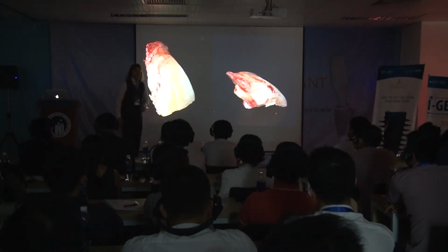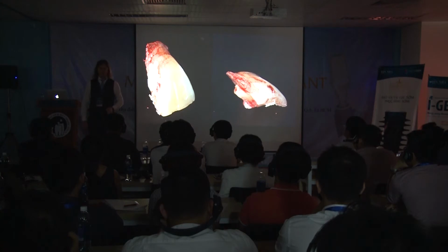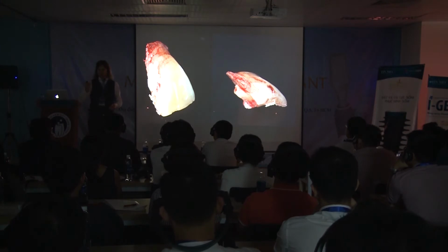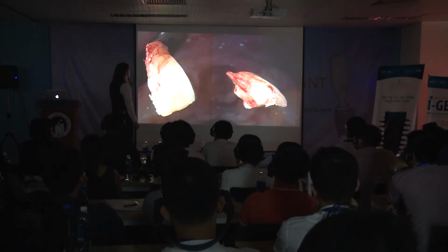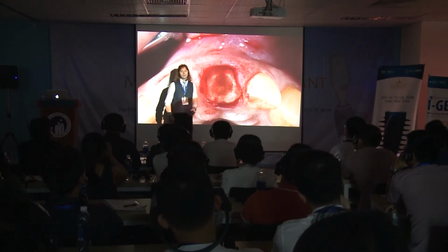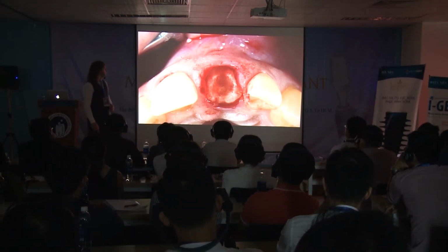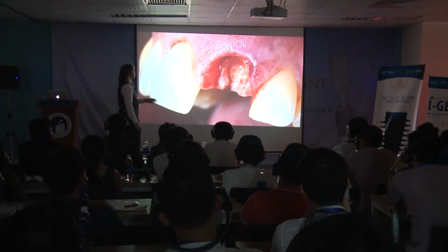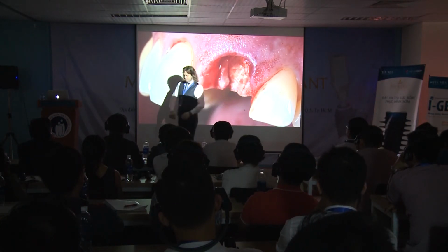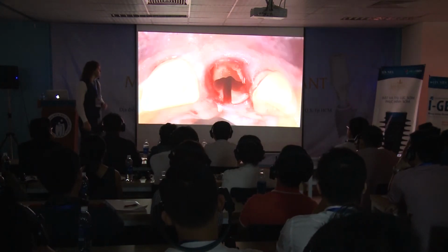This is the part broken. If only this was a problem, I would have kept the root, and I would have done orthodontic extrusion. But there were other fractures inside. There was no way to keep it. You see? This is all exploded. So I had to remove it.